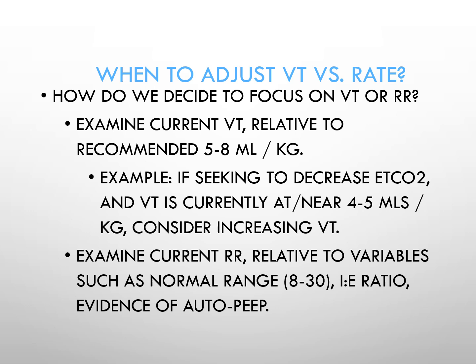So just a little bit of critical thinking. It's not magic or anything along those lines. Examine the current tidal volume relative to recommended, 6 to 8, or 5 to 8 mLs per kg. I'm about 5'9.5", and my ideal body weight is probably about 75 or 80 kgs. So a reasonably good tidal volume for me is between 450 and 500.